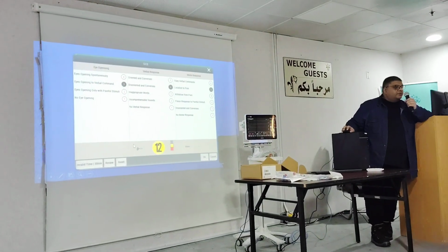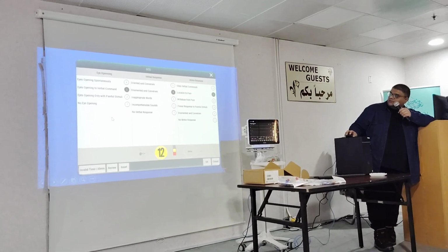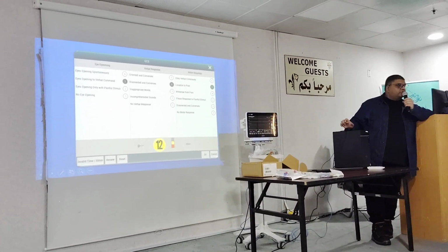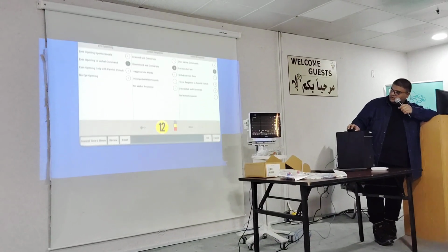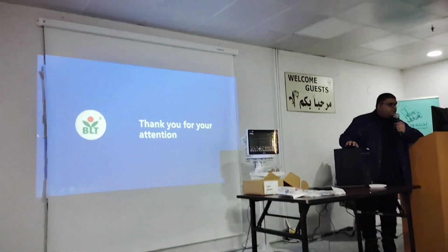And GCS, do you use the GCS score? Yes. You can use GCS over here based on the patient's response. You can click, and it will show you the value directly on the monitor. Okay, so that's all for the presentation.